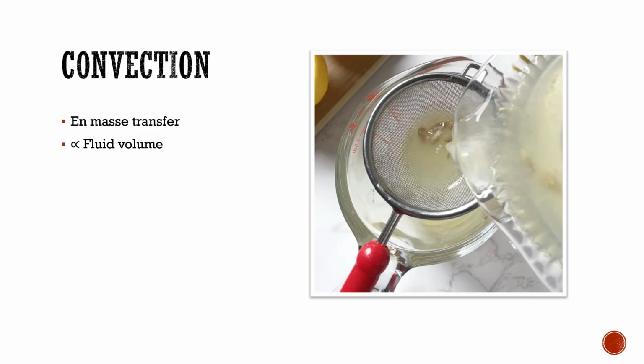If you pour just a little, only a small amount crosses over. If you pour the entire jar, a lot of solutes, both big and small, move along with it. This is convection, or solvent drag. Solutes being carried by moving water. Unlike diffusion, here there is net water movement and the solutes travel along with it, limited only by the pore size of the filter.